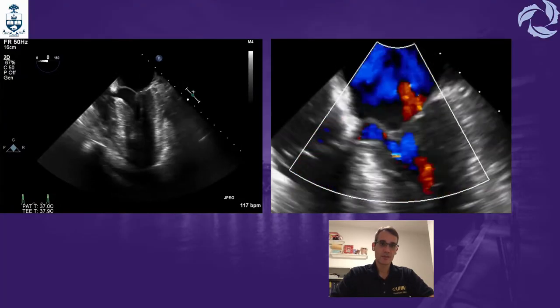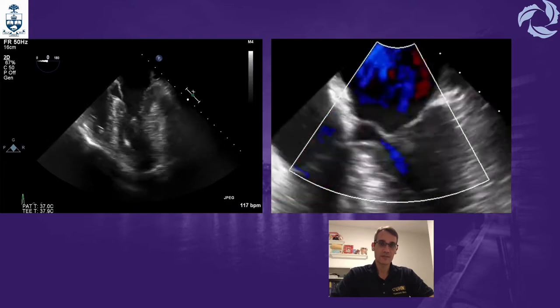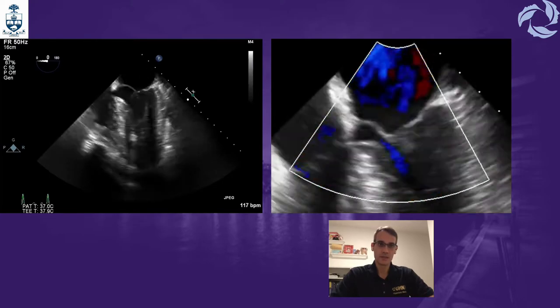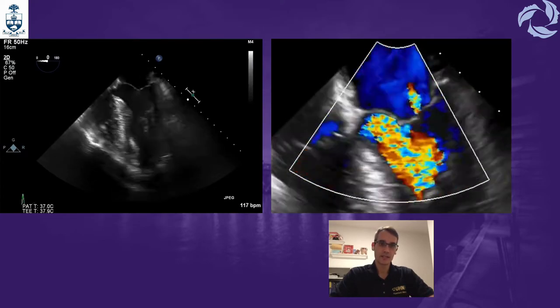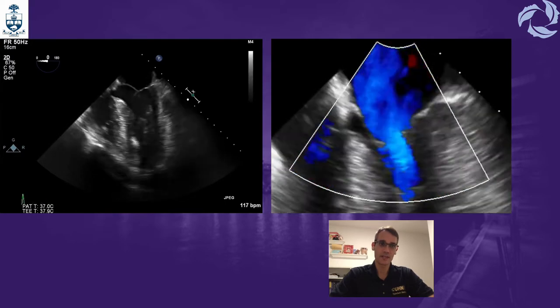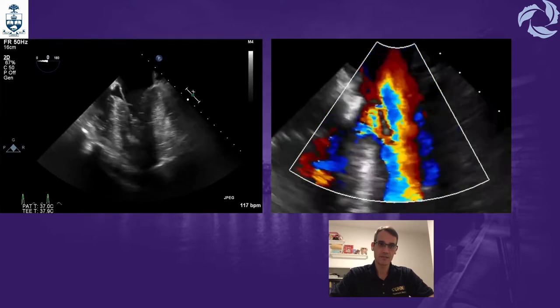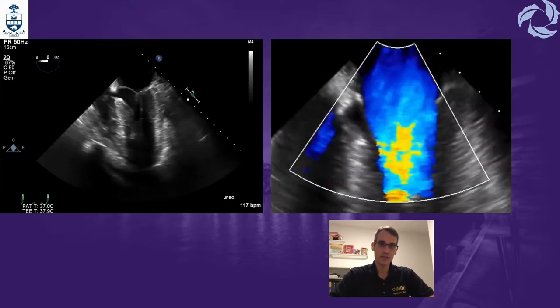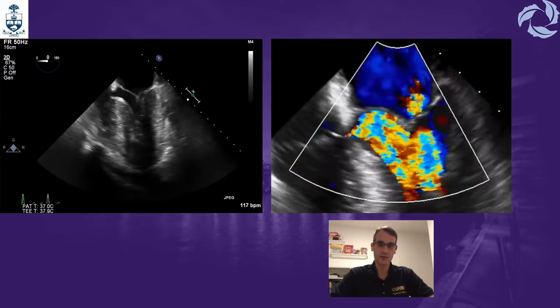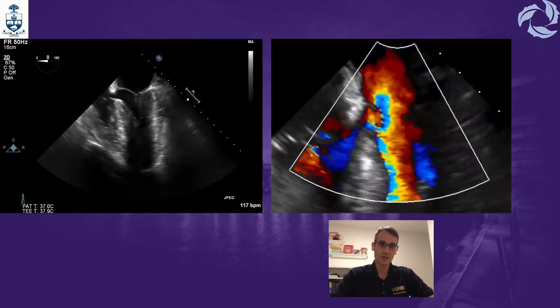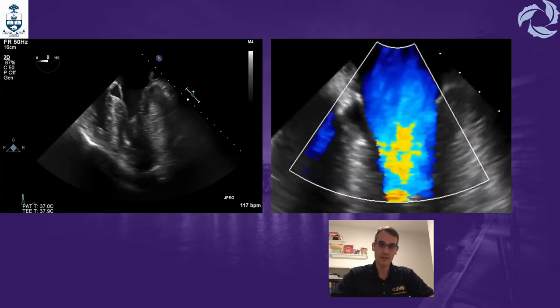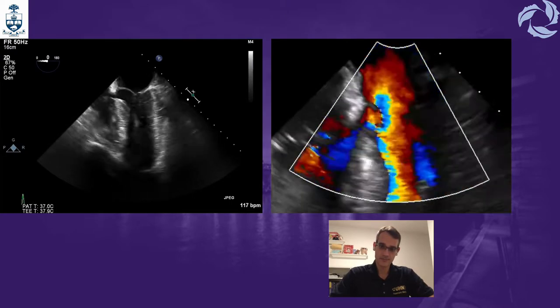As we can see in this example, starting with the picture on the left side of the screen, we have a left ventricle and right ventricle from a 4-5 chamber mid-esophageal view, where you can see the left ventricle is very reduced inside, very hyperdynamic. The same principle can be applied to the right ventricle. The image on the right is a zoom view over the mitral valve and the LVOT tract, where you can see the yellow flow acceleration representing flow acceleration through the LVOT and a posteriorly directed jet into the mitral valve.